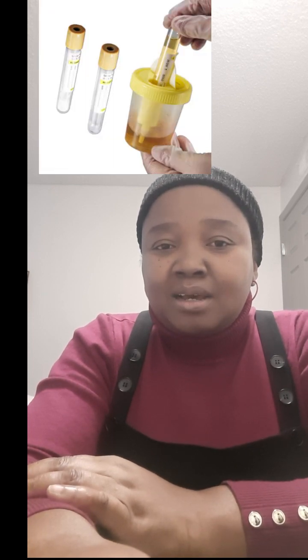Then another thing I want to bring up is getting urine samples from these catheters. The catheters have urine sample pots, where you can get urine to take a sterile sample. There are two types of pots. There's one that is needleless and there's one that you can use a needle on.